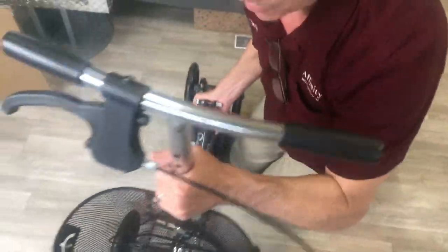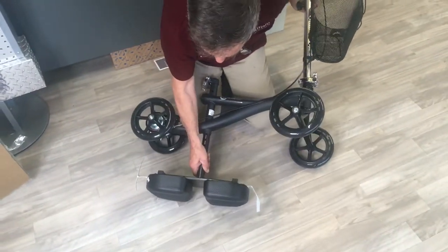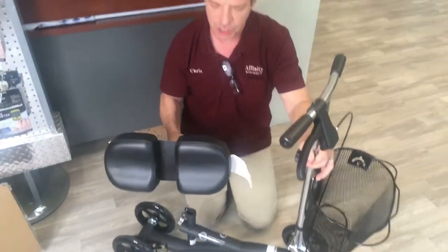Now back to the seat. Remember, the seat is on the bottom — that's really just for shipping purposes. It makes it easier and a little smaller to ship.